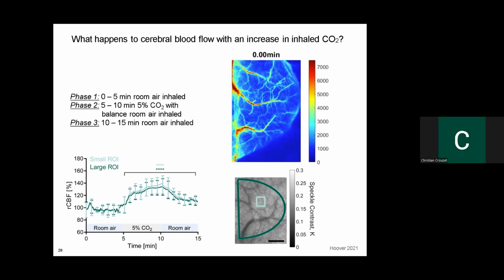Specular reflection can cause issues because it would just be saturated, and it will artificially have a low contrast, because if your detector is saturated, all the values are, say, in an 8-bit detector, 255. So you don't have any resolution to resolve anything. So yes, you want to polarize light going in, and typically cross-polarize light coming out to minimize any specular reflection.